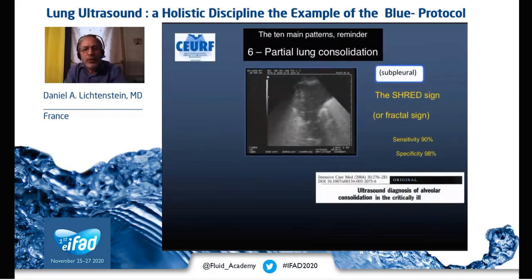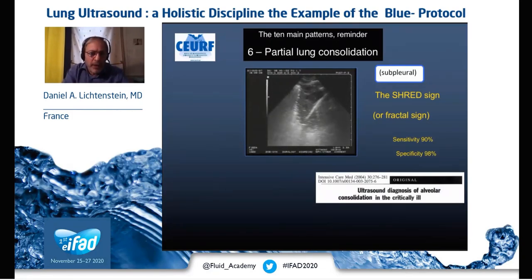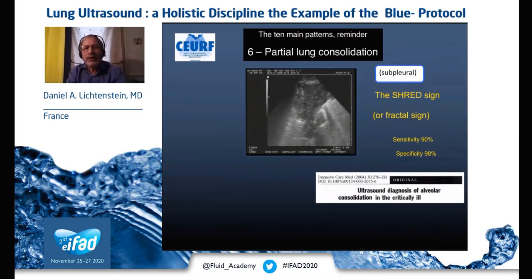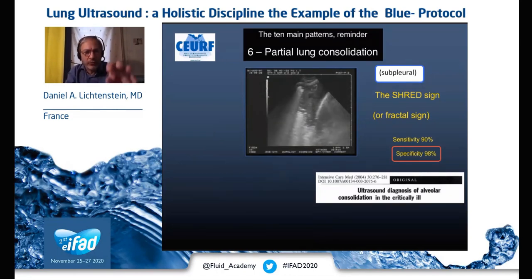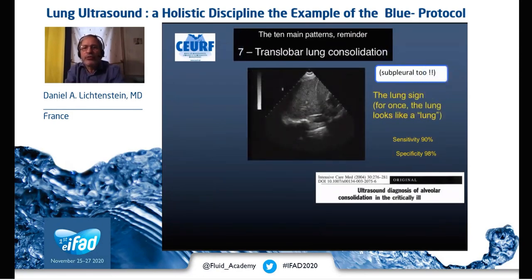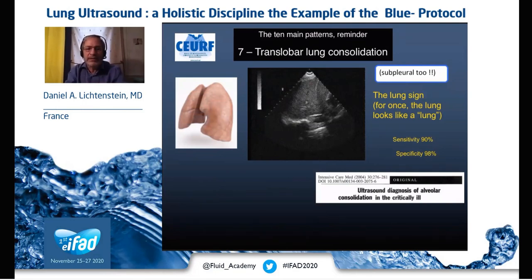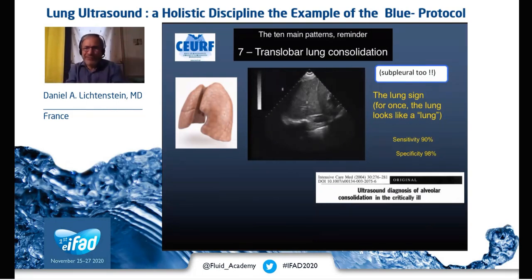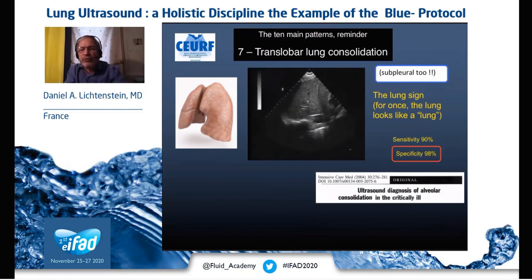Lung consolidation can be partial, like a subpleural consolidation, where we have the shred sign or fractal sign — which clearly indicates lung consolidation. That is the shredded area between the consolidated lung and the air beneath. Here we see a translobar lung consolidation where the whole lung is consolidated; we call this the lung sign, which is completely specific to translobar lung consolidation.